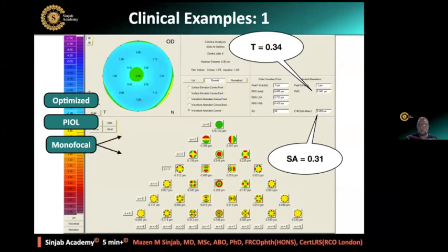And if we are going to implant monofocal, of course, to understand what I'm presenting now, the zero spherical aberration and so on, you have to know the PSIS algorithm. Now, it is available in my videos. So if we are planning to get benefit of his spherical aberration, which is 0.31, for depth of focus, we have to keep it. So we implant a monofocal which is zero spherical aberration. Okay, so to keep it. If we keep it, the patient has some depth of focus.